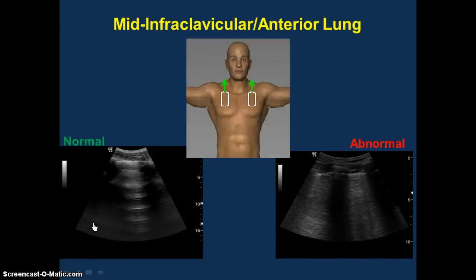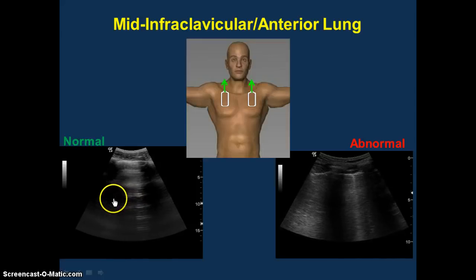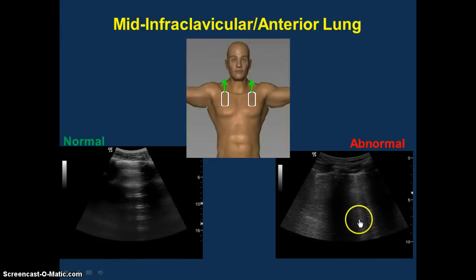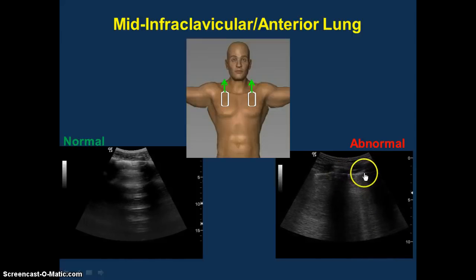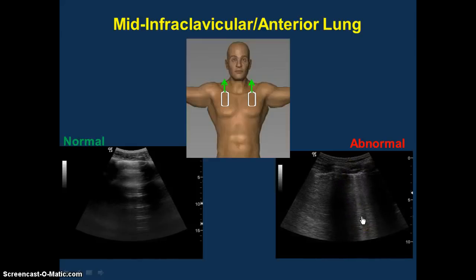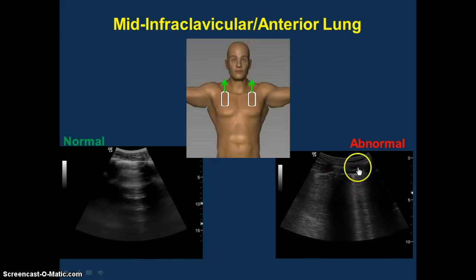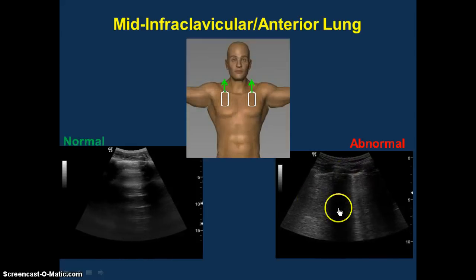Just because the lung is aerated doesn't mean it's normal — you can get this pattern in asthma, COPD, or even pneumothorax. What we're looking for is to determine whether the lung is aerated or wet. This is an example of wet lung. Here you see rib with shadow, rib with shadow, you see the lung sliding back and forth, and then you see these vertical artifact patterns we call B-lines. When you see multiple B-lines — meaning more than three in one intercostal space — that's suggestive of a wet lung. We're looking for bilateral evidence of B-lines, which suggest pulmonary edema.